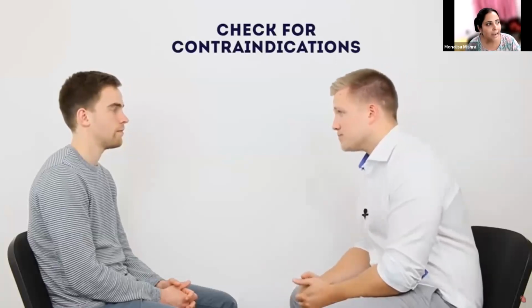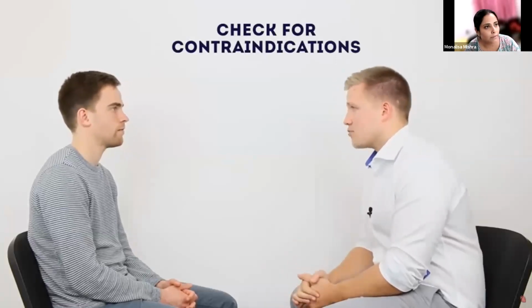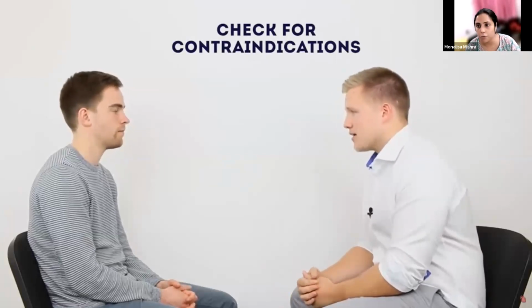So always remember to wash your hands. If the patient is conscious, introduce yourself and always tell what you're going to do. Confirm the patient details. That is number one, that this is the patient you want to take the ABG from. And then you explain the procedure, what you're going to do. And after that, if the patient is conscious, you have to gain consent. Check for indications and contraindications. Do you actually need the ABG? And what are the contraindications you need to be aware of before taking an ABG? If the patient is on warfarin or heparin, you have to ask those questions.